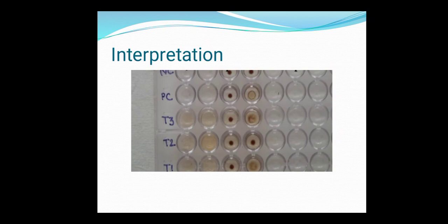We also have the quantitative test, which is performed on the sample that is tested positive by this qualitative test. So this is all about the TPHA test.